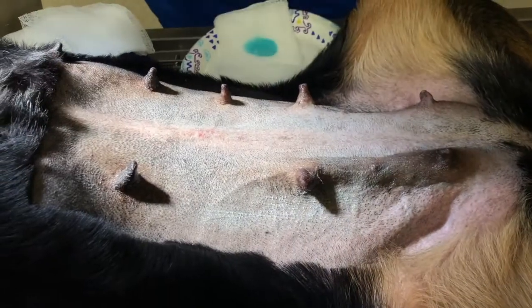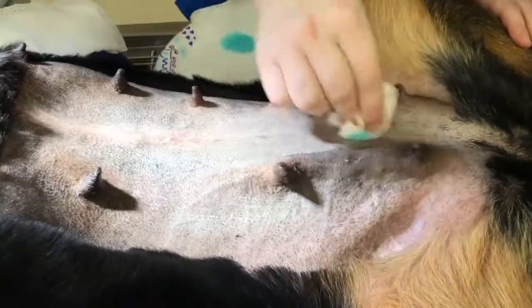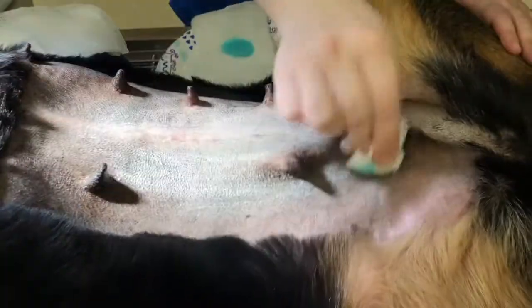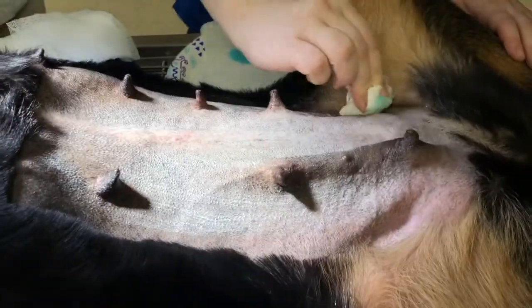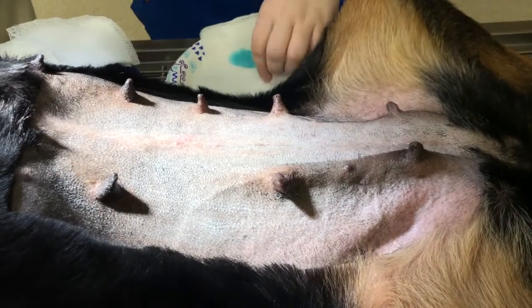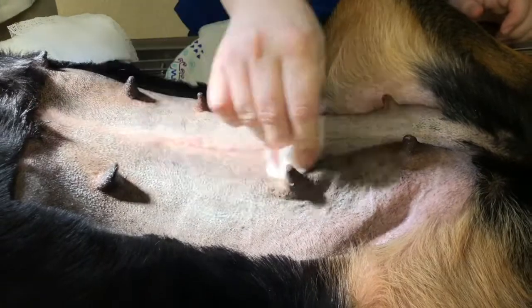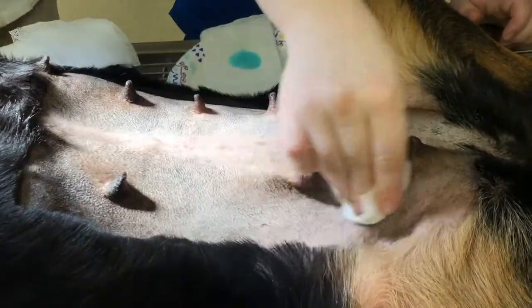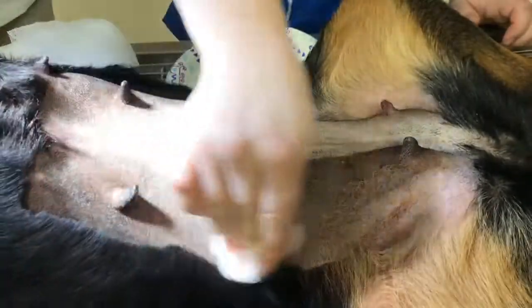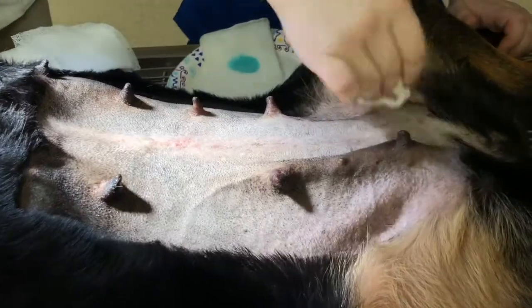The thing about bacteria is that we can't see it — we don't know where it is. So when we do this surgery prep, Emma's starting in the center and moving out to the periphery as she goes. She starts at the surgical site and moves outward as she scrubs. The cleanest spot is right in the middle, and if she happens to pick up some bacteria on the gauze square, she'll be dragging it outward. We do this multiple times to make sure it's clean.